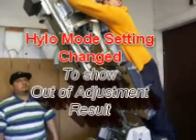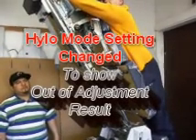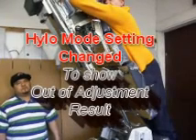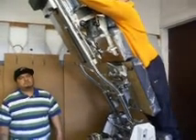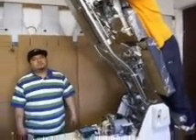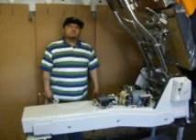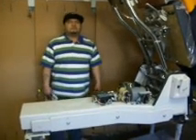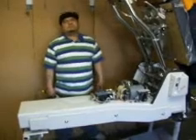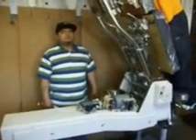Alright, so we've upset the setting on the valve pack in Hylo mode. What we're going to see is a cycle where the table is going to come down in Hylo mode. When it reaches virtually the bottom of the cycle, it's going to jerk and bump, and then we're going to see that the transition from Hylo mode to VertiLift mode is going to be greatly interrupted.